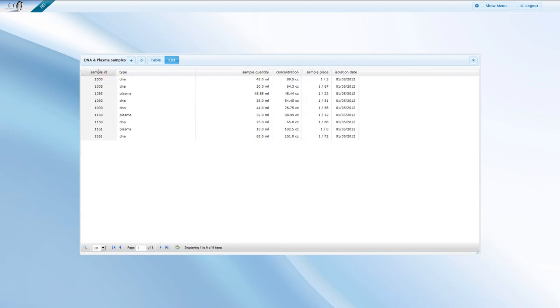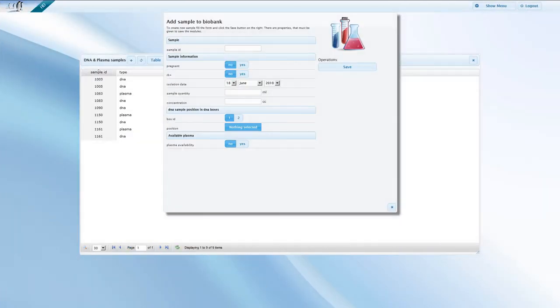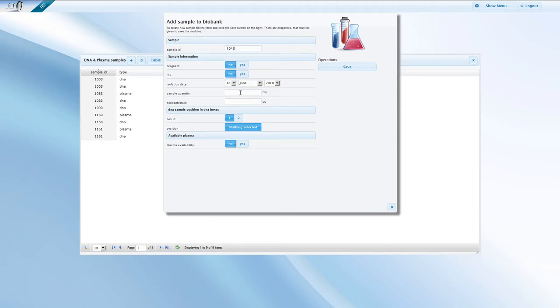Let us now add a sample by clicking on the plus icon. As with the patient form, this form is also entirely customizable. Start filling in the form by entering the sample ID.